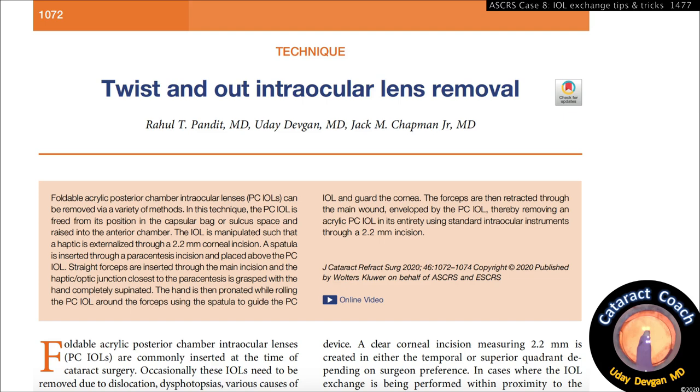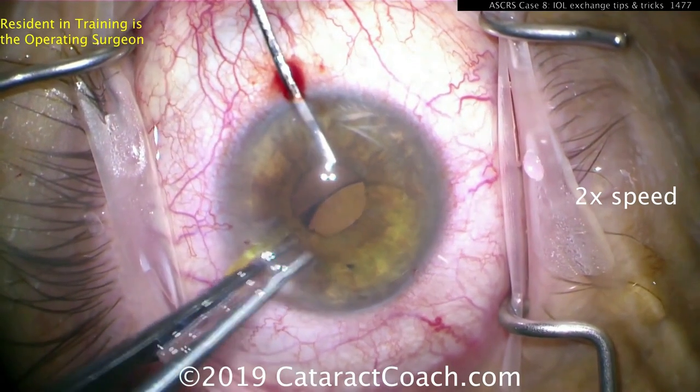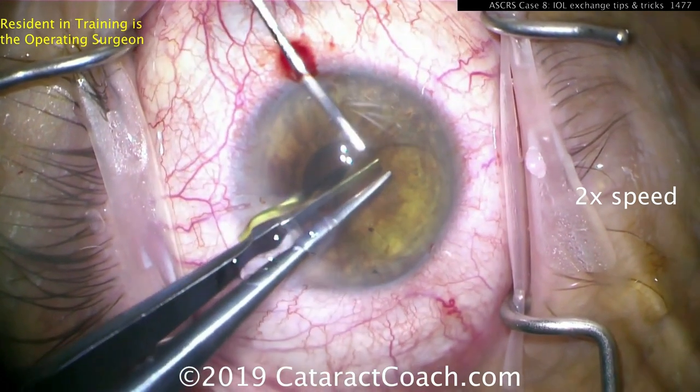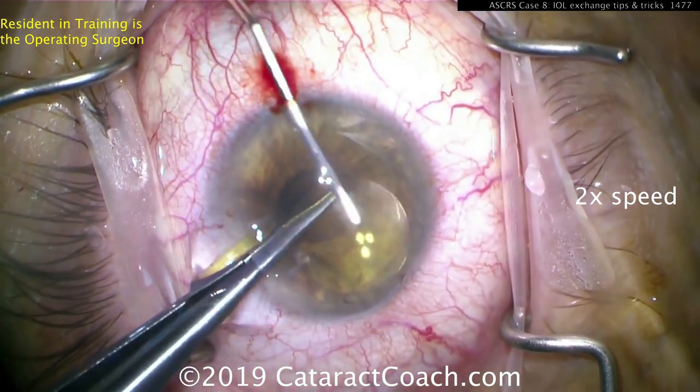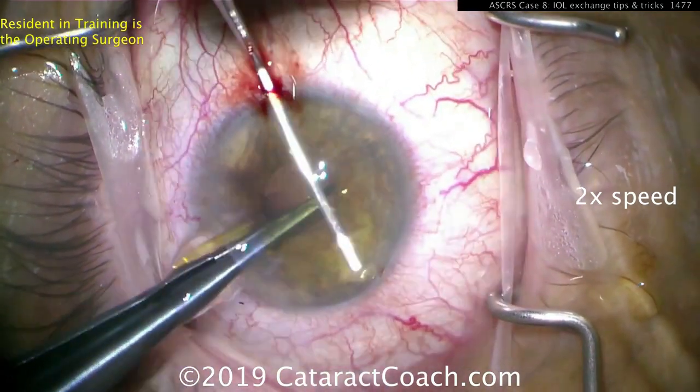We've published this with co-authors in the JCRS. The key is to start with the hand supinated so you can pronate it, then keep rotating to remove the lens. Here's a resident doing it in the beginning stage of training — grasping the edge of the optic with the eye full of viscoelastic.